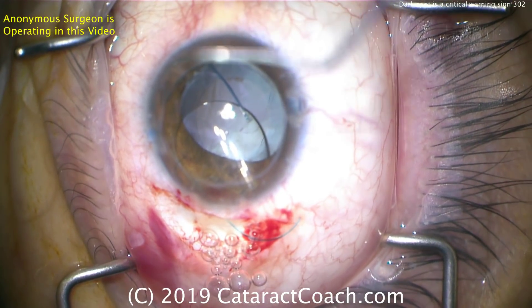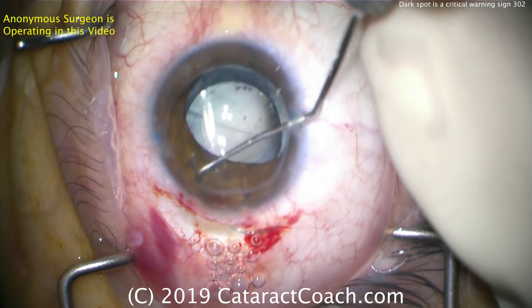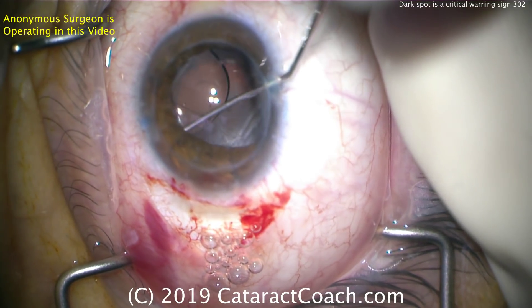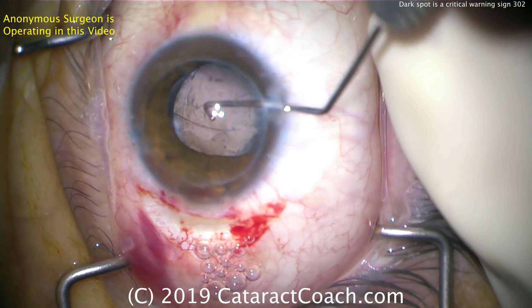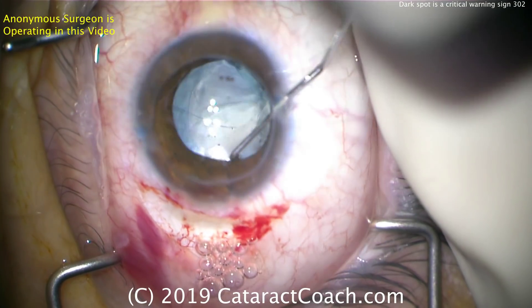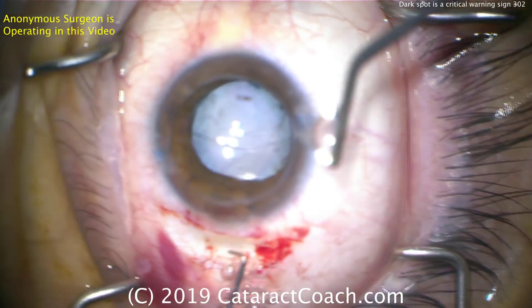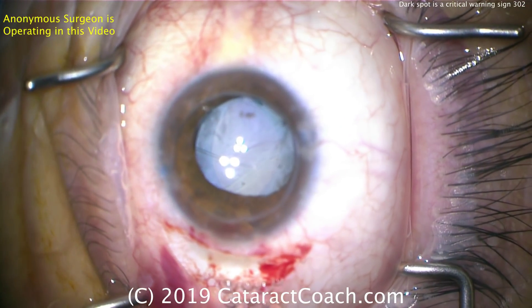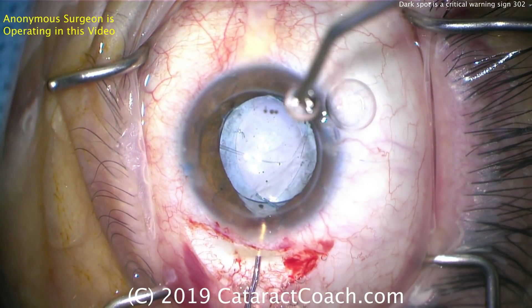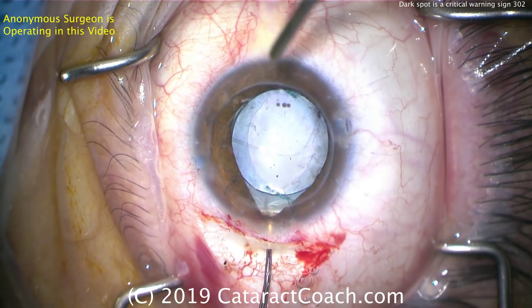Excellent. Now it's time to get that lens positioned. If you are going to send this patient to your vitreoretinal colleague for a pars plana vitrectomy and pars plana lensectomy, definitely clean up the anterior segment, don't leave any lens material there, and definitely put in a lens like this. If you have the support for a sulcus lens, get that sulcus lens in. That looks great — and now it looks like optic capture, which is even better. This is a very good long-term stable solution. You can see the shape of the capsulorrhexis is now rhomboid. The haptics are in the sulcus above the capsule rim, and the optic has been placed like a button through a buttonhole through the capsulorrhexis — so it's behind the anterior lens capsule. This is the optic capture technique. Beautiful result, and it will have a very nice long-term effect.